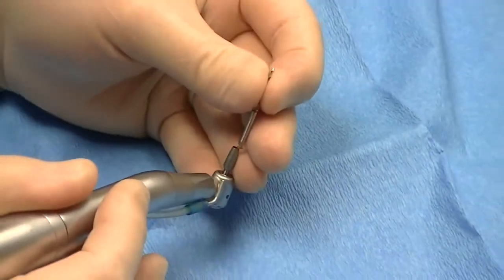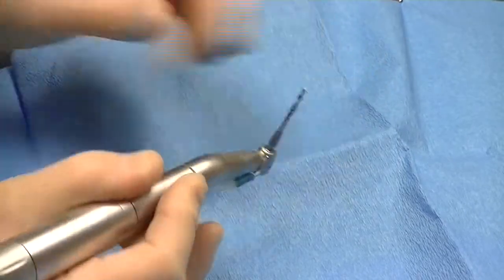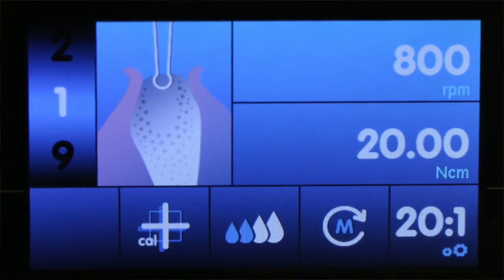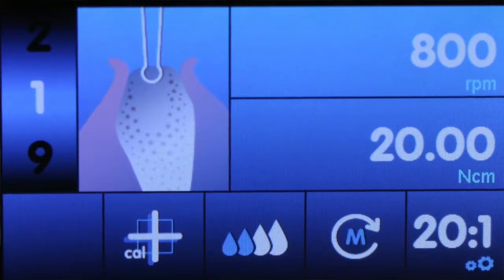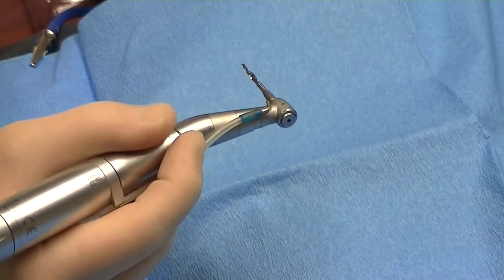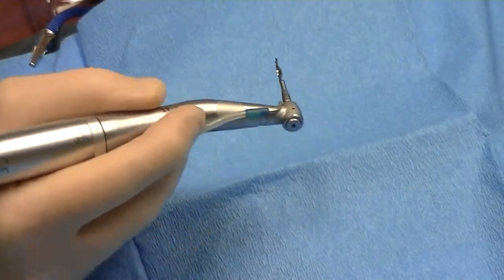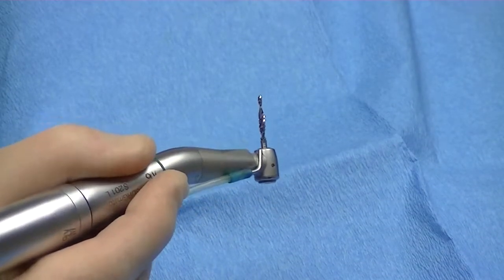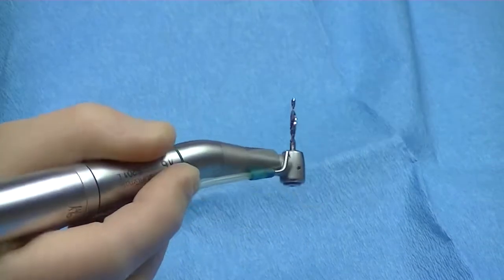We'll place the implant approximately in this position. Our rules: we must be at least 2mm from the PDL of the adjacent tooth, and adjacent implants need to be at least 3mm apart. Before we begin, we'll make our initial penetration into hard tissue using a 2.4mm diameter pilot burr — a very small, very sharp burr that perforates the cortical bone. I'm not going to full depth; this burr helps me angle the implant mesio-distally and visualize the final implant position faciopalatally. At about 800 RPM and 20-25 Ncm of torque — slow but very efficient.